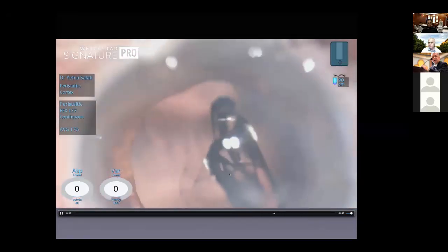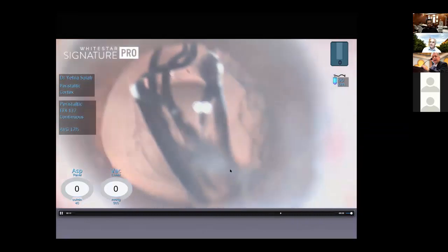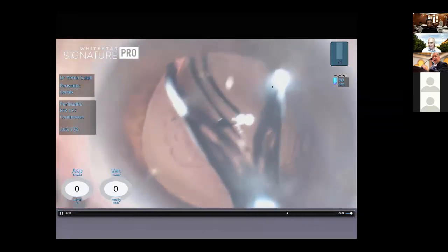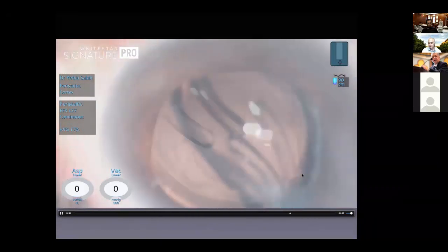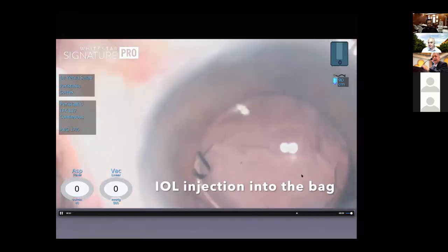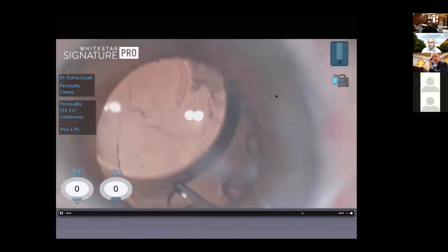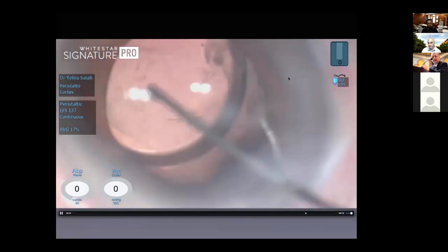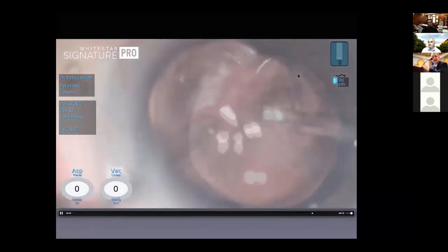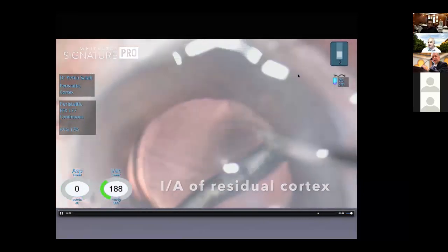Now I decided to inject the lens. This is a hydrophobic acrylic lens implanted in the capsular bag. I know I have still remaining cortex here. Making sure the lens is injected inside the capsular bag, well centered, making sure that you are in front of the posterior capsular edge, behind the anterior edge. Once you have done this, you have sealed the opening with the optic, then you can do irrigation aspiration as normal.